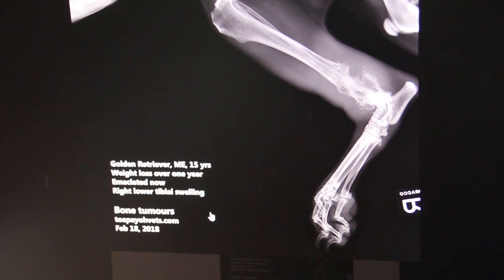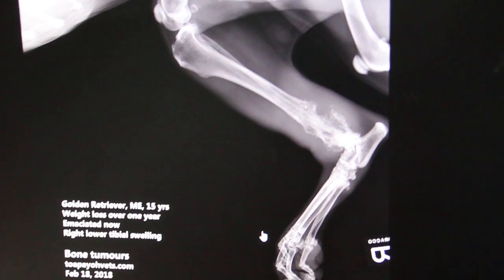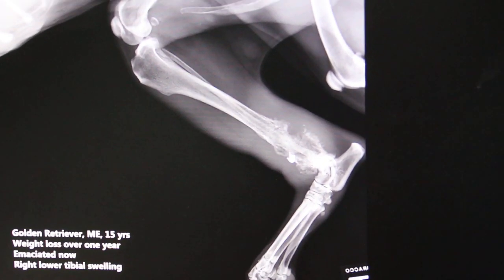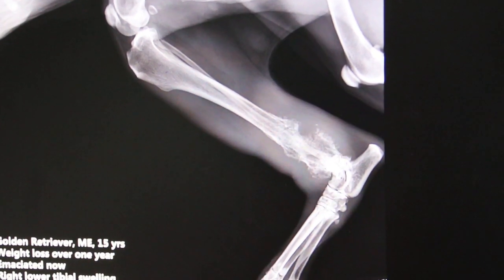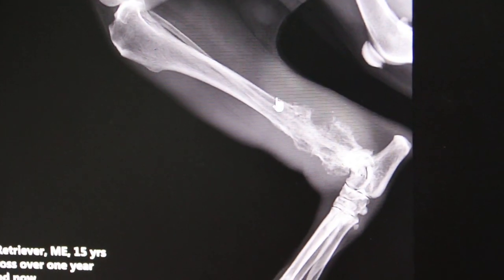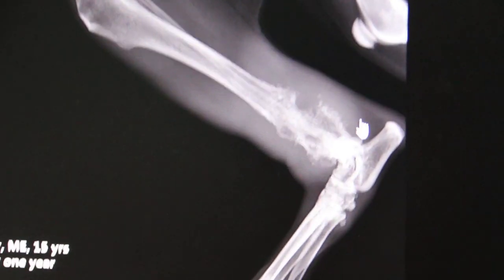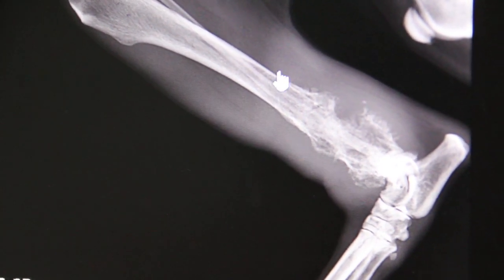That means the right hind leg is swollen. And you can see from the x-ray, it shows bone destruction. There is the lower leg — the tibial bone and the fibula bone. As you can see, circled, it's badly destroyed, likely to be cancerous.